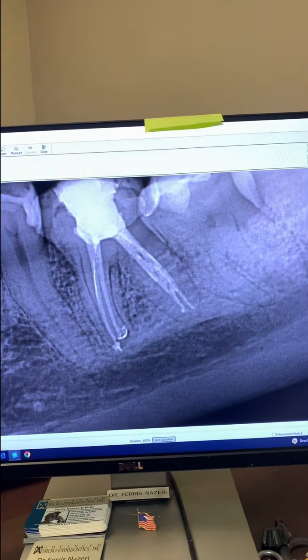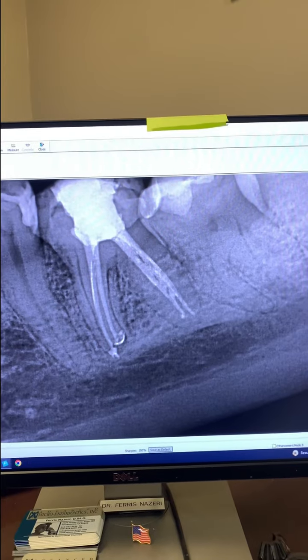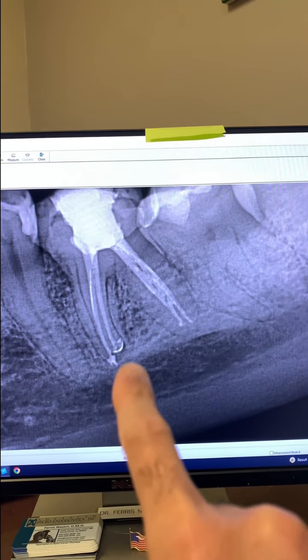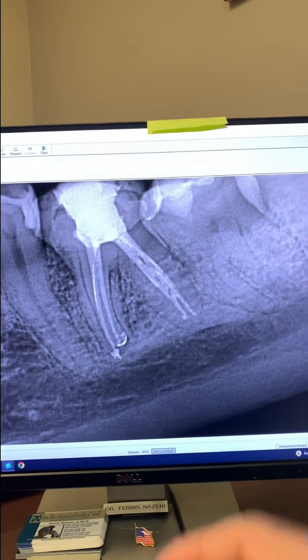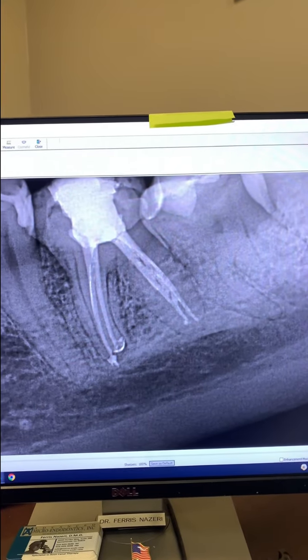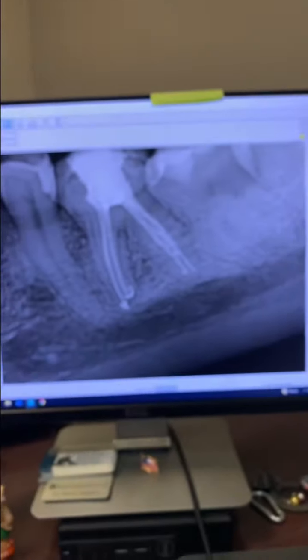So we did this root canal in 1 appointment, right? And there's sealer puff here. Should I have done this in multiple appointments because there was a lesion? That's one question. Does sealer extrusion cause endodontic failure? That's another question. And here is the date, as you can see, 2 years ago when we did this root canal for her.